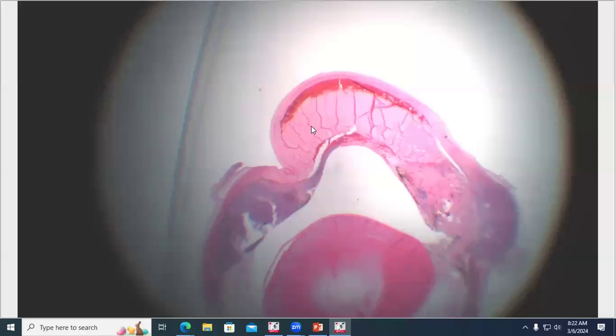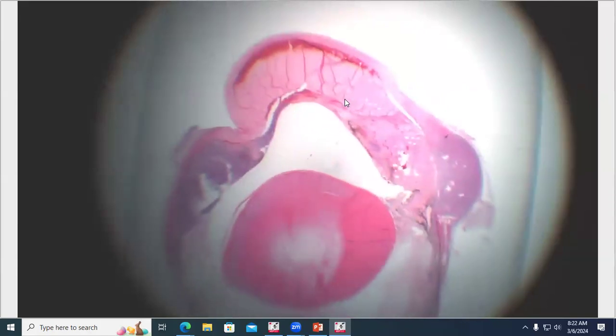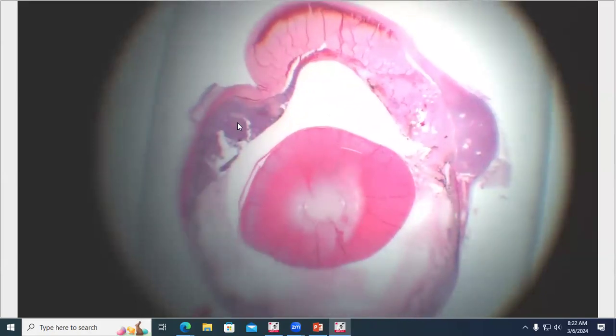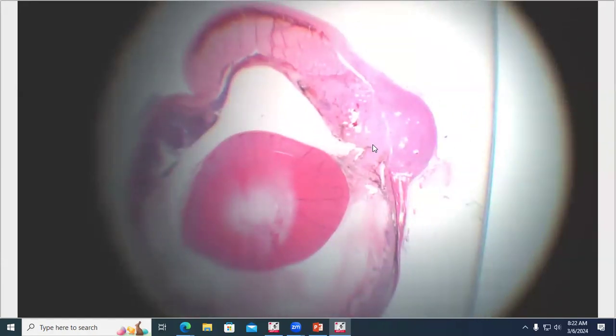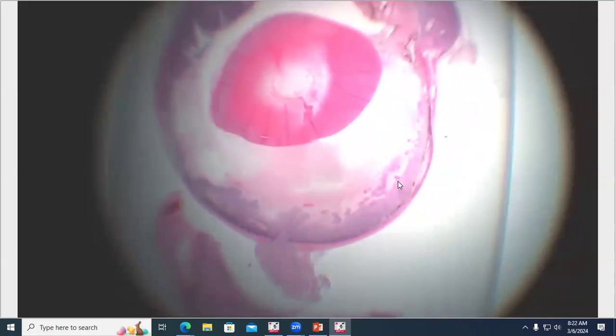All right. So here's our subgross view, cornea at the top. Here's that gel and hemorrhage in the anterior chamber, nice eosinophilic proteinaceous material. Here are the iris leaflets, really thick and very hypercellular. The one on this side looks a little bit more pink. And here's that bulge that we noted grossly. Lens not too bad. And then you can see all of that hypercellularity extends circumferentially around the back of the globe, into the optic nerve head. And then here we can see it again on our gonio slice.